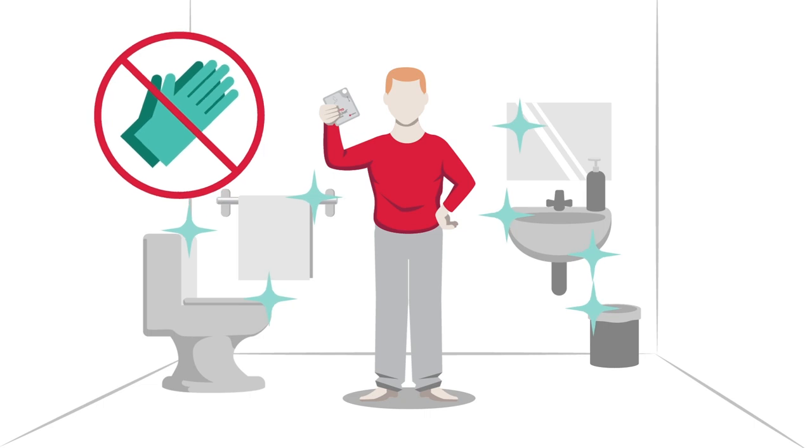Good to know: gloves are not really necessary in home situations when using any Vapro Pocket catheter.